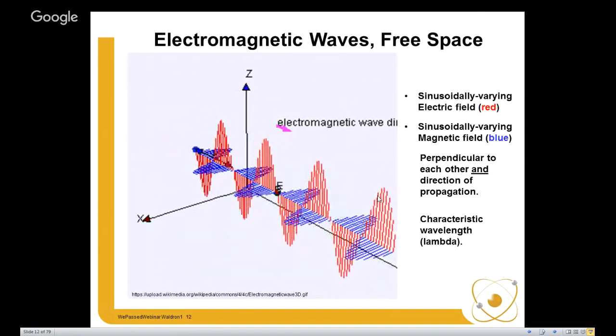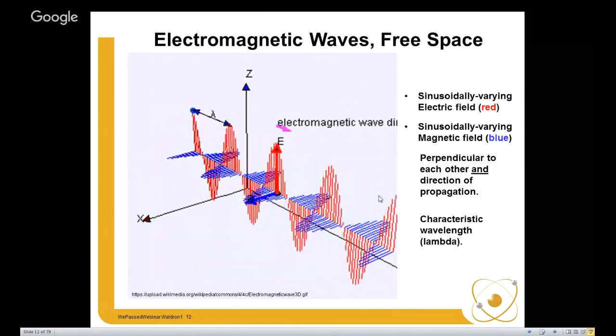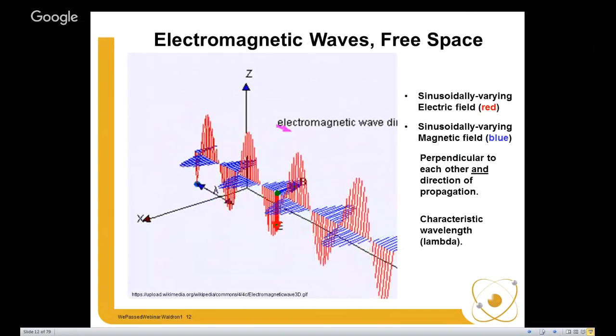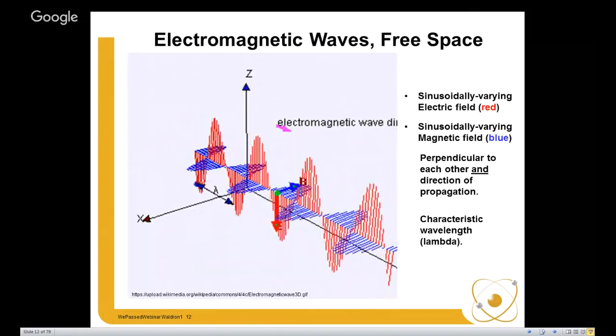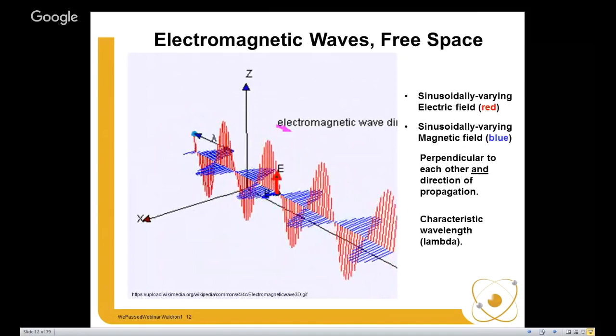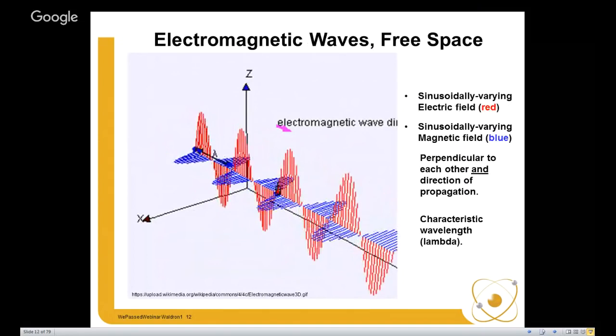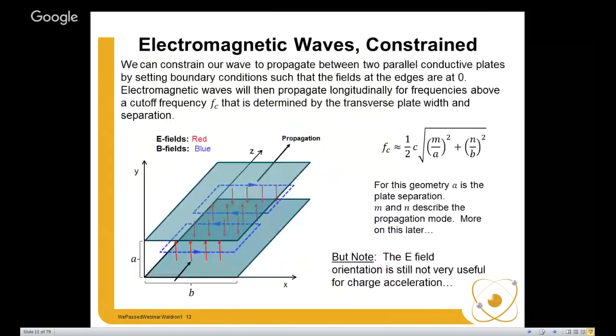By itself, this is of very little use to us in terms of accelerating electrons for medical use. However, I think we should understand it if we're going to use it to do that acceleration. What we can do is constrain our electromagnetic wave to a container.